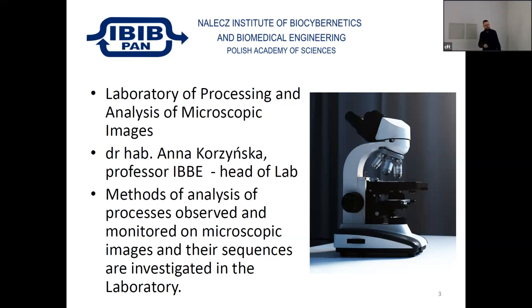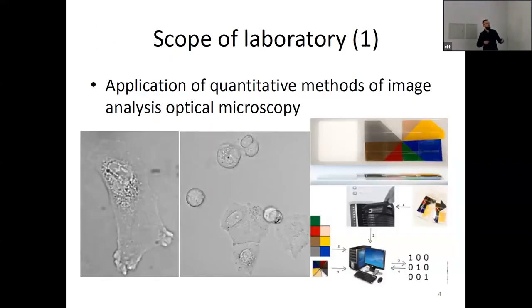And mostly we were involved in the application of quantitative methods for microscopic images, like presented here. We have fibroblasts, where we analyze the movement of the fibroblasts, and also, for example, color standardization of the images from the microscope. We established some normalization methods based on colorful slides, visible on the slide.